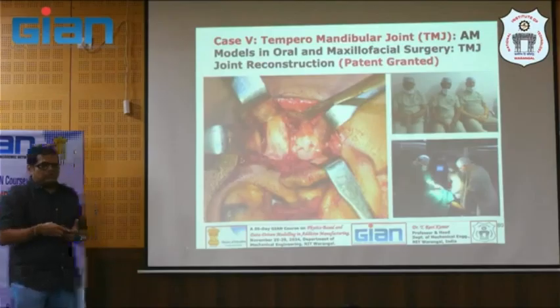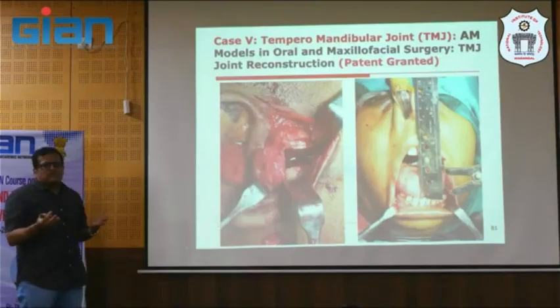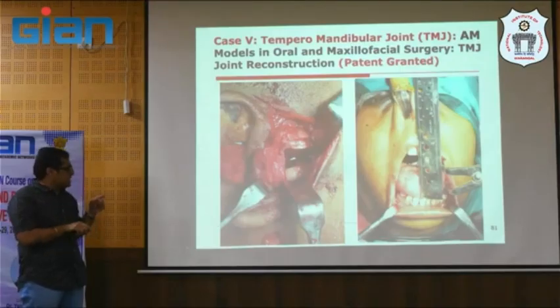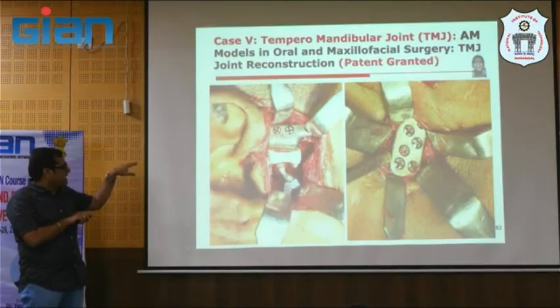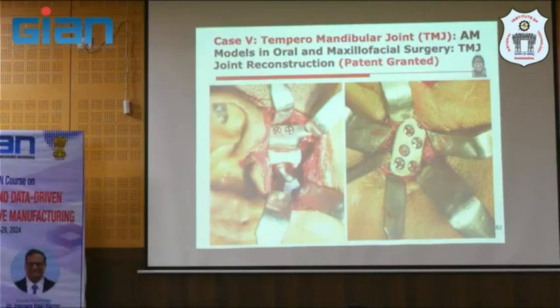It is a very brutal kind of surgery, but nevertheless, for the past 20 years she has been surviving, and once the joint has been released after 20 years, now she could open her mouth 5 or 6 centimeters, right? So after 21 years, and this is during the surgery, these implants have been fixed from the upper jaw, that's called maxilla, and the lower jaw, mandible. This is the mandible side, and this is the maxilla side. Now she is doing good, and she got engaged recently.